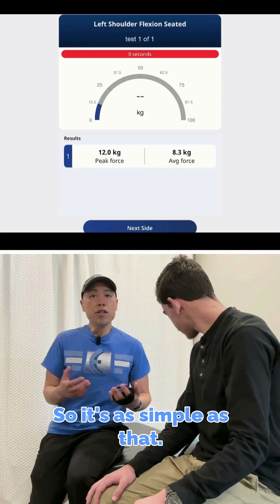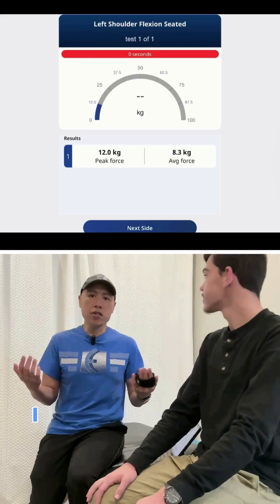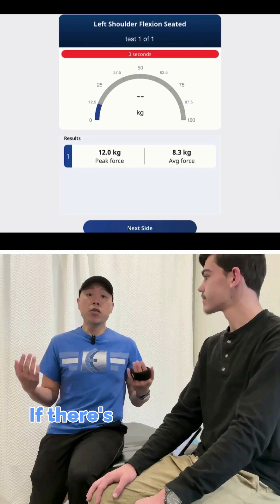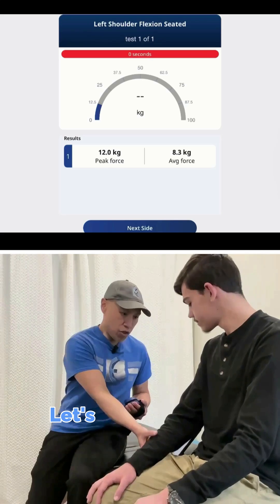So it's as simple as that. You can do as many tests as you want — three, five tests. I usually do one maximal test and have the patient hold it for five seconds. If there's a greater than 10% difference, then that would be significant.